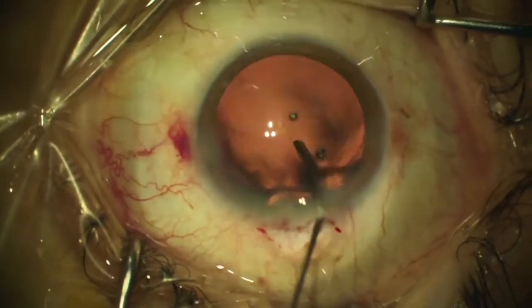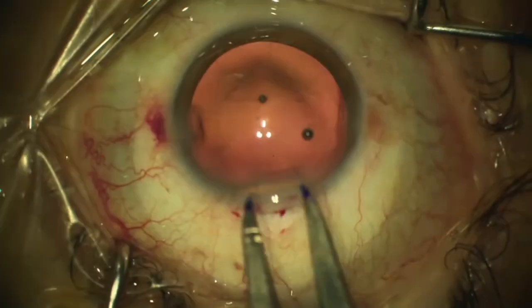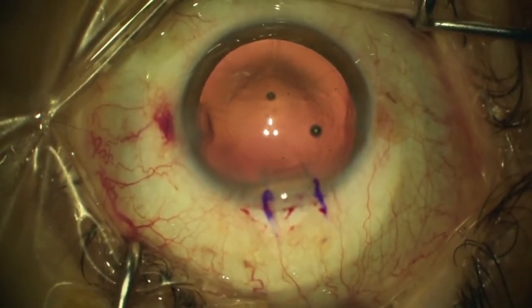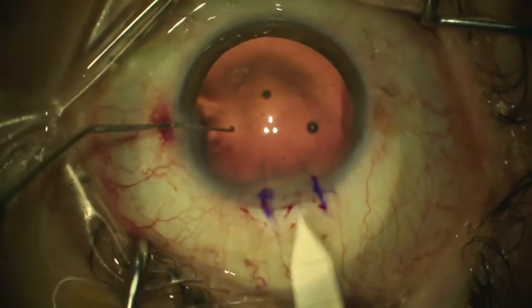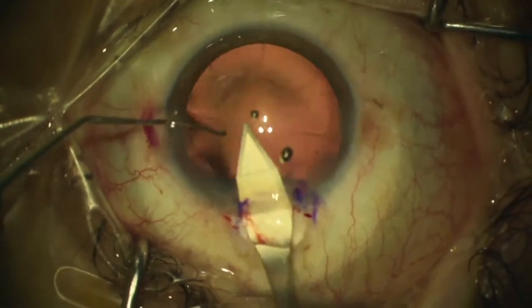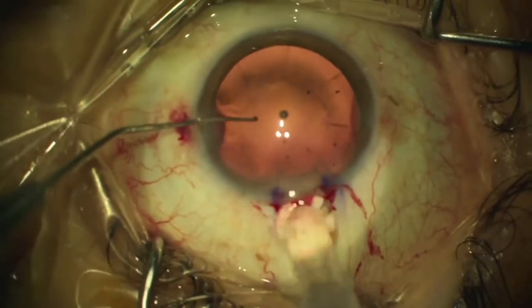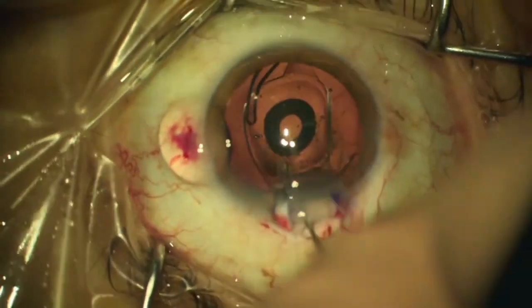The chamber is stabilized with OVD and the perilimbal incision is now opened to 3.5 mm. The IC8 is prepared for implantation and the shooter is inserted ready for delivery. The plus 28 diopter IC8 is centered within the capsular bag.